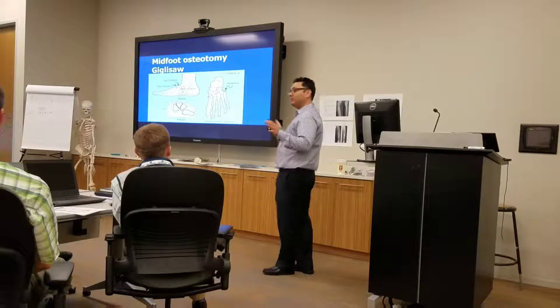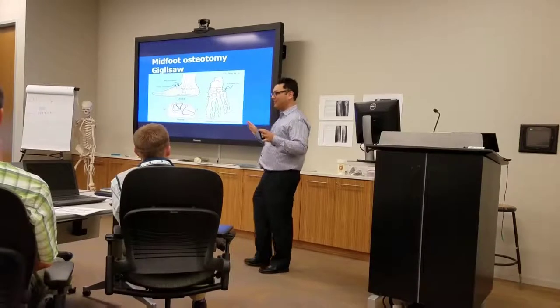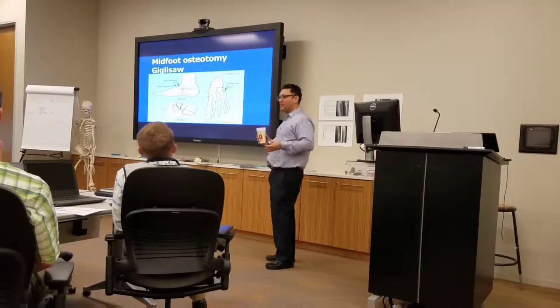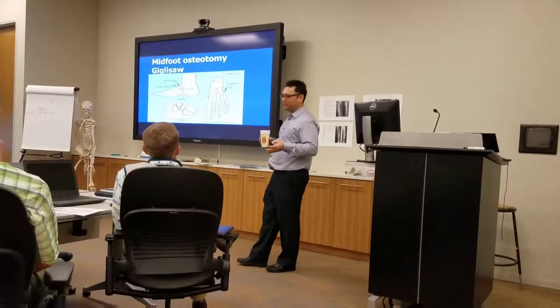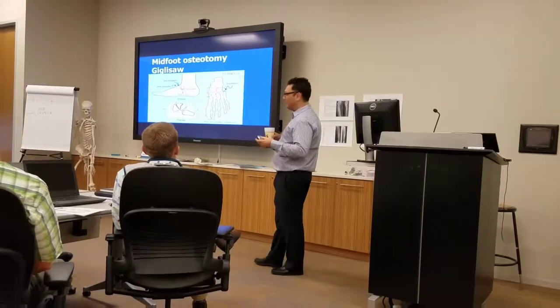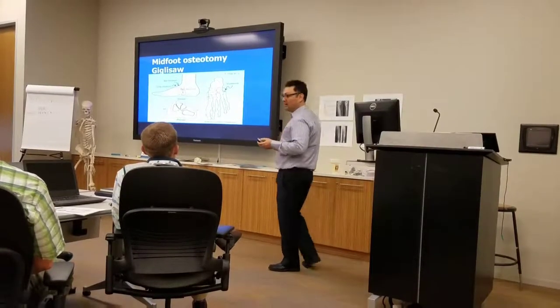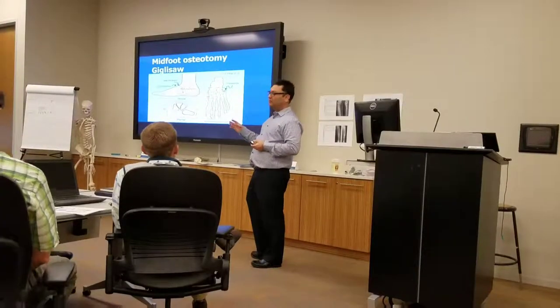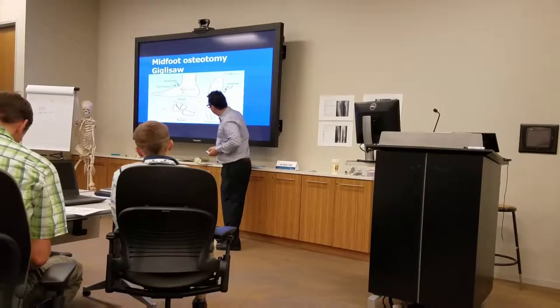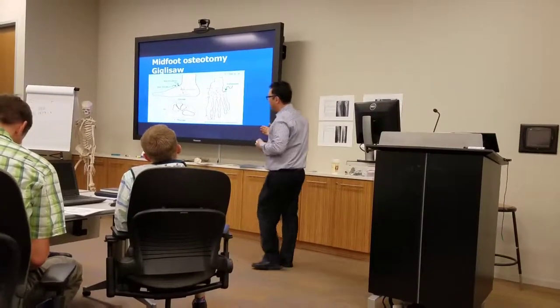But before that, we will now show you the Gigli osteotomy. I really want to see more pictures of that, because if you want these frames to work well, you want your osteotomy placed properly and safely. That will make your case a lot easier and be best for the patient's outcome. The beauty of the Gigli saw osteotomy as opposed to the open procedure is you can place that Gigli saw almost anywhere. You can get talar head, talar neck, navicular, cuneiform, across the cuneiform. You can put it in many different places.